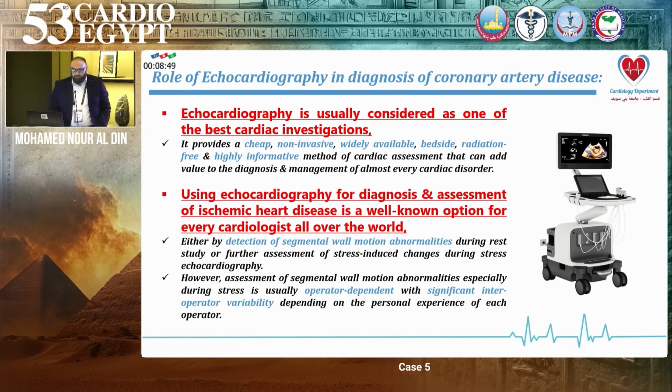However, echocardiography is usually considered one of the best cardiac investigations, being cheap, non-invasive, widely available, bedside, radiation-free, and highly informative. Using echocardiography for diagnosis and assessment of ischemic heart disease is a well-known option for every cardiologist, but it depends mainly on segmental wall motion abnormalities during the rest study or even during stress-induced studies. However, it is usually operator-dependent, and there is significant inter-operator variability.